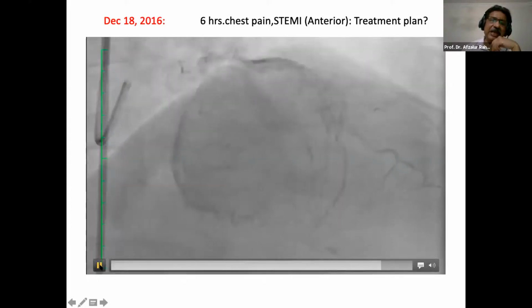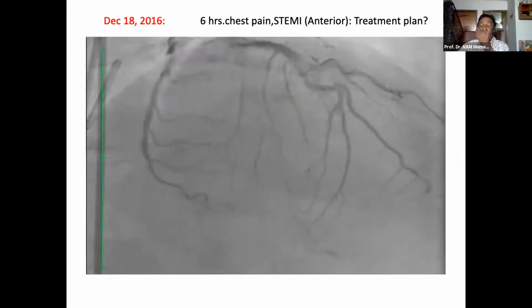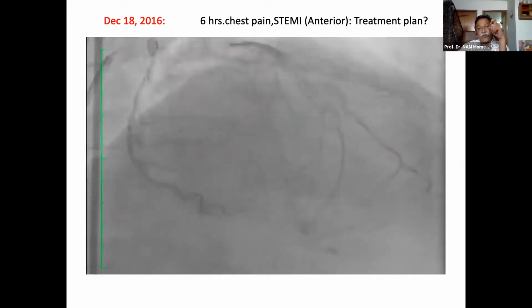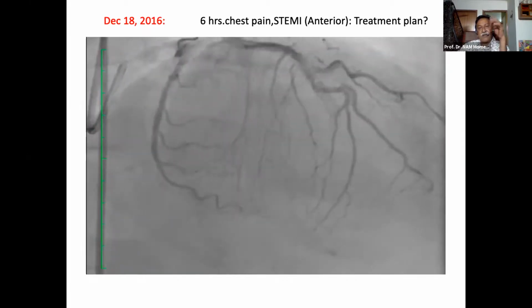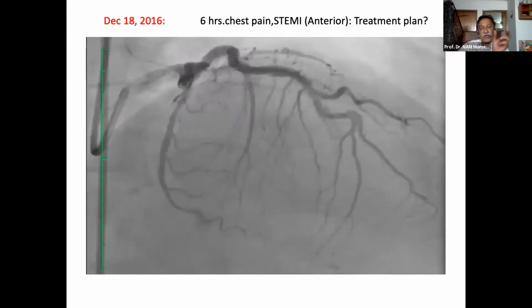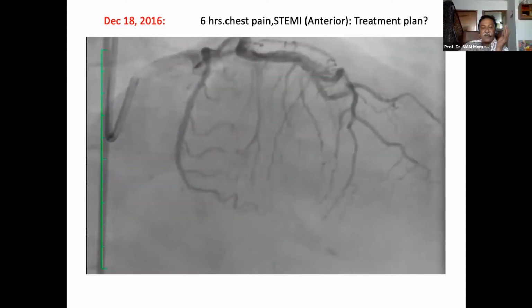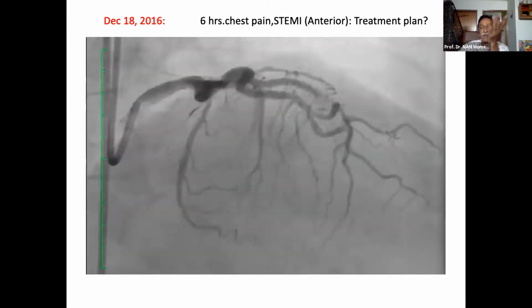You can see this fracture is at the level of the angulation of the coronary artery. It can happen in the acute situation or in the chronic situation, especially where there is an acute bend that acts as a hinge. That place may be the site for the fracture. But in acute, it is mostly because of over dilatation. And usually it happens in the calcific lesion.